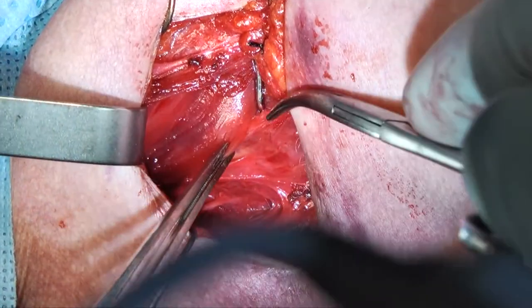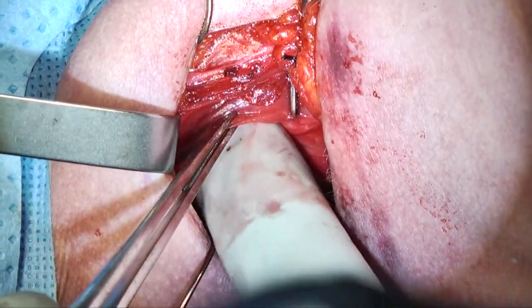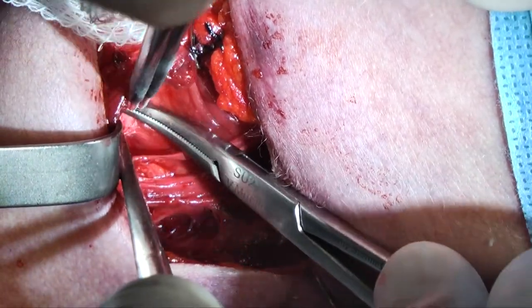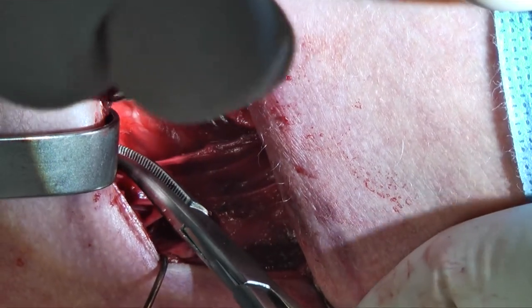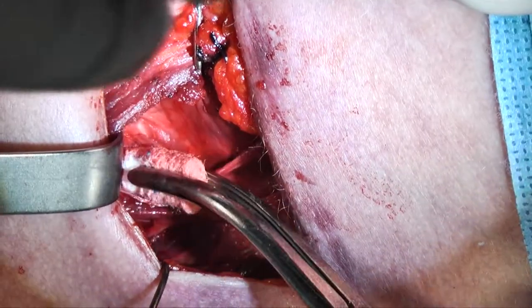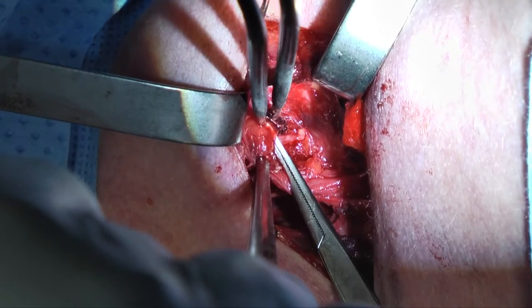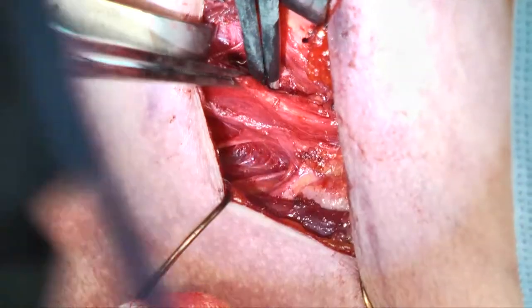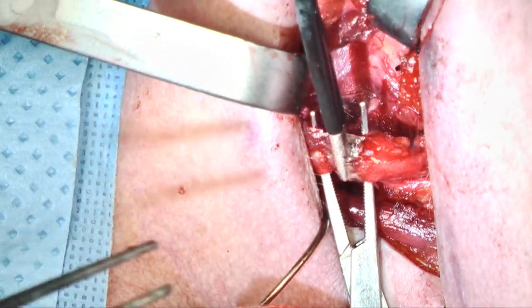Now we're switching over to find the recurrent laryngeal nerve. I go on a lateral plane, pulling the strap muscles over with a hook and rotating the thyroid cartilage over as well. Then we start looking for the nerve, dissecting out strap muscles and finding where the thyroid gland is. Occasionally you have to take the superior pole of the thyroid gland and pull it inferiorly to better find the nerve. Here's the nerve now — you can find the cricopharyngeal muscle as well, which helps show where the nerve is, as does the cricothyroid joint. Just posterior to the joint is where the nerve is entering.